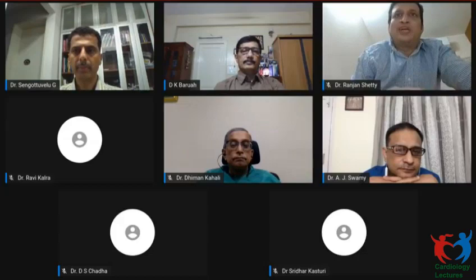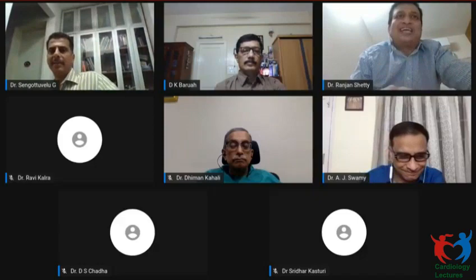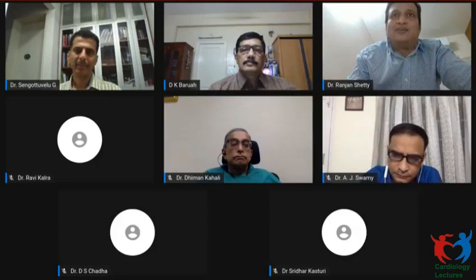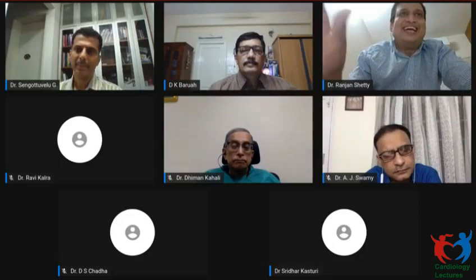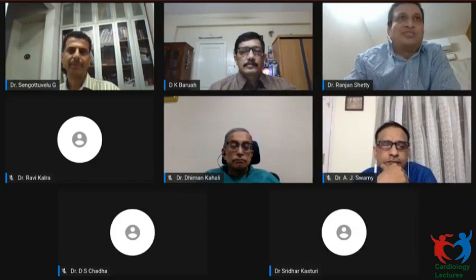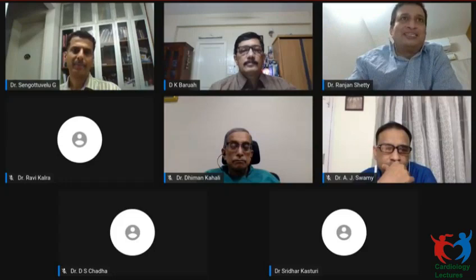Can you unmute yourself, please, Dr. Ranjan? Yeah. Thank you, Dr. Sangatvelu. It's a very interesting case in the sense that calcium there is probably deciding a lot because otherwise it's a smaller diagonal. And if you see that proximal, there's one more diagonal which seems to be a little bigger than this diagonal and that has ostial stenosis. So among the diagonals, probably that will be a preferred diagonal. So if I have to do it, most likely I would go for a provisional stenting because the diagonal I feel is a little smaller and LAD definitely is very big, but it's at that D2 junction.